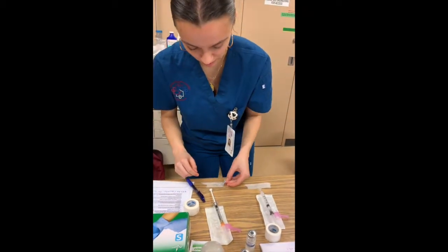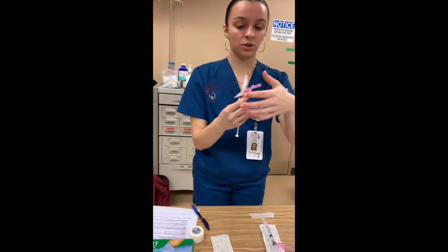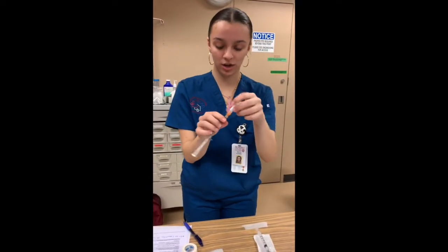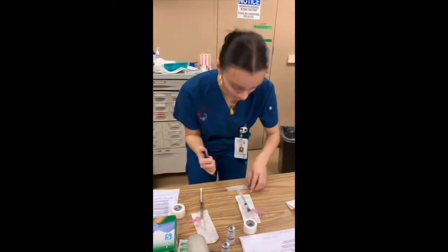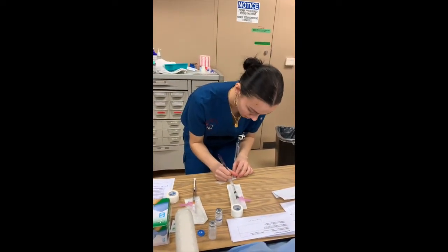So now I have this, I'm going to put it on the cap of the needle, just to make sure it is a proper identification. And for other health members, just to be aware of the type of medication that Mr. Mancini got. I'm going to do the same thing for the intramuscular as well. I'm going to be writing his full name. So Mancini Mario.